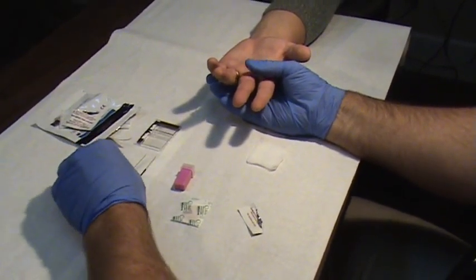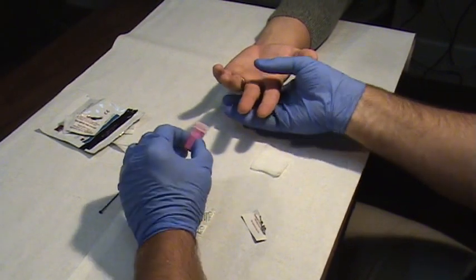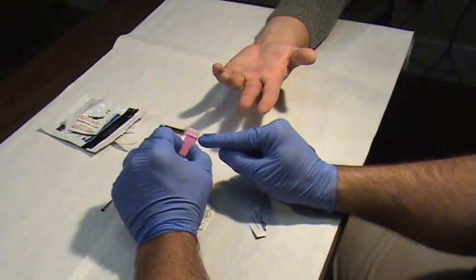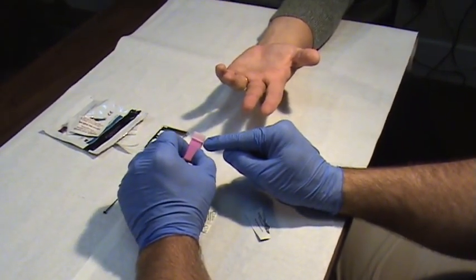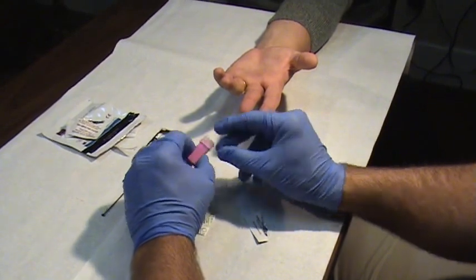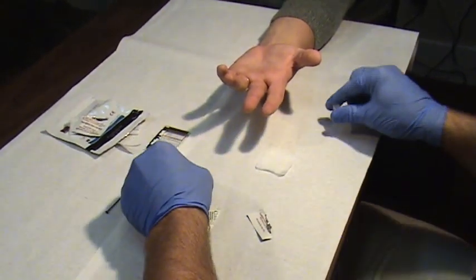When you're using the lancet, you want to make sure that the cap is left on it until you're ready to use it. It gives confidence to the patient that it's never been used before. They'll see you removing the cap.